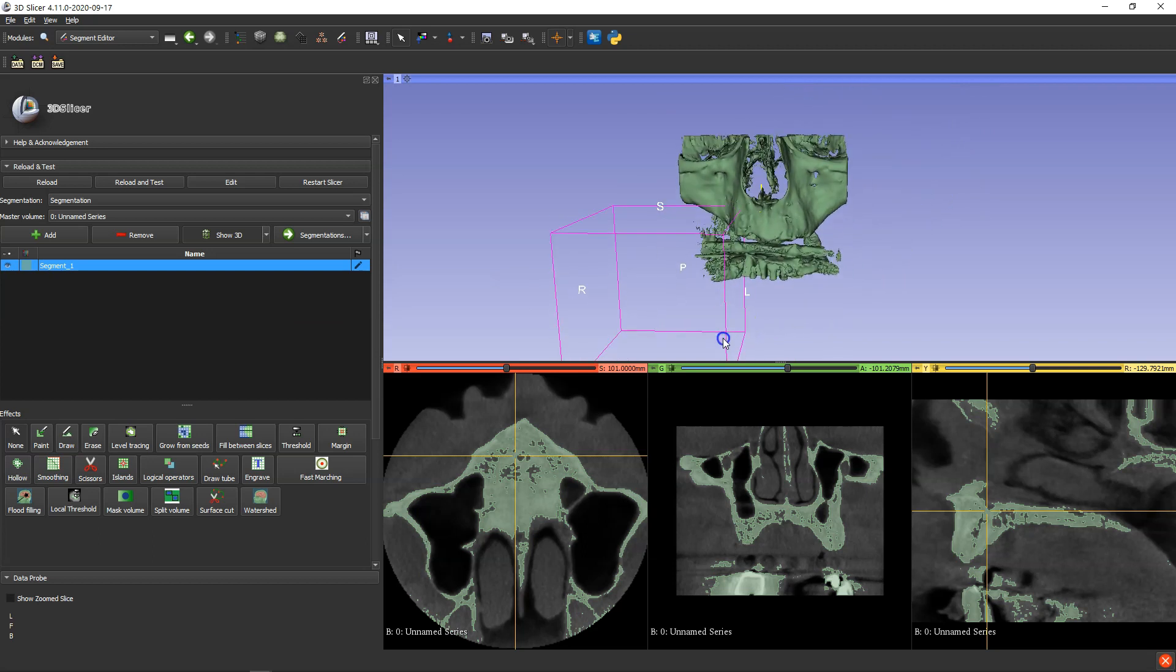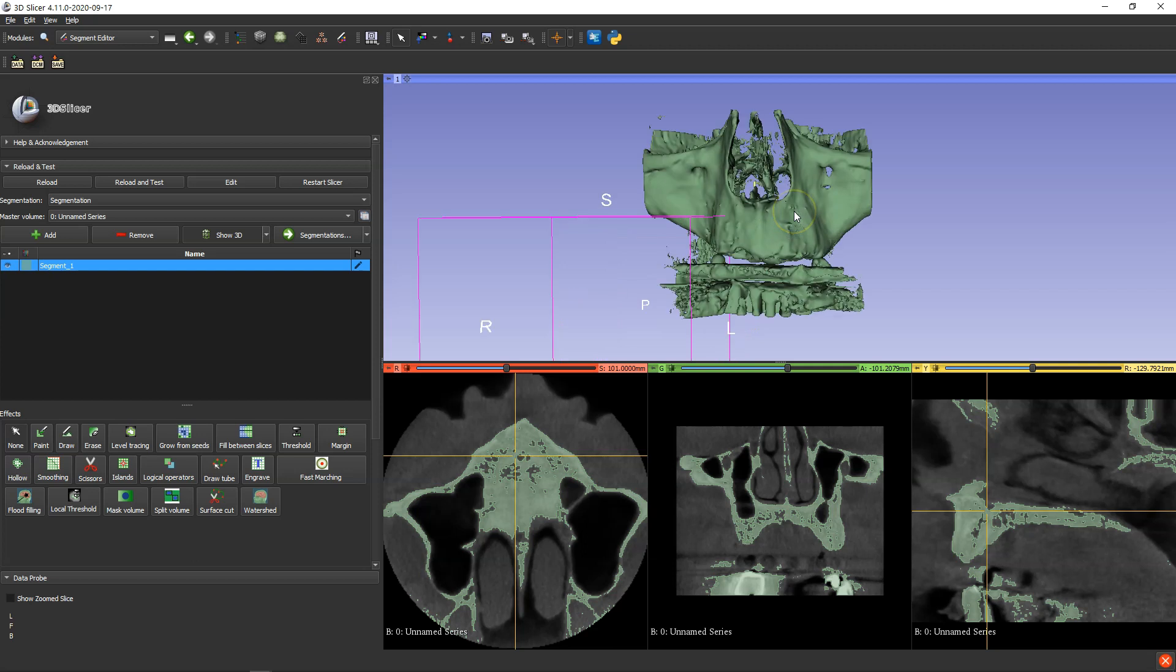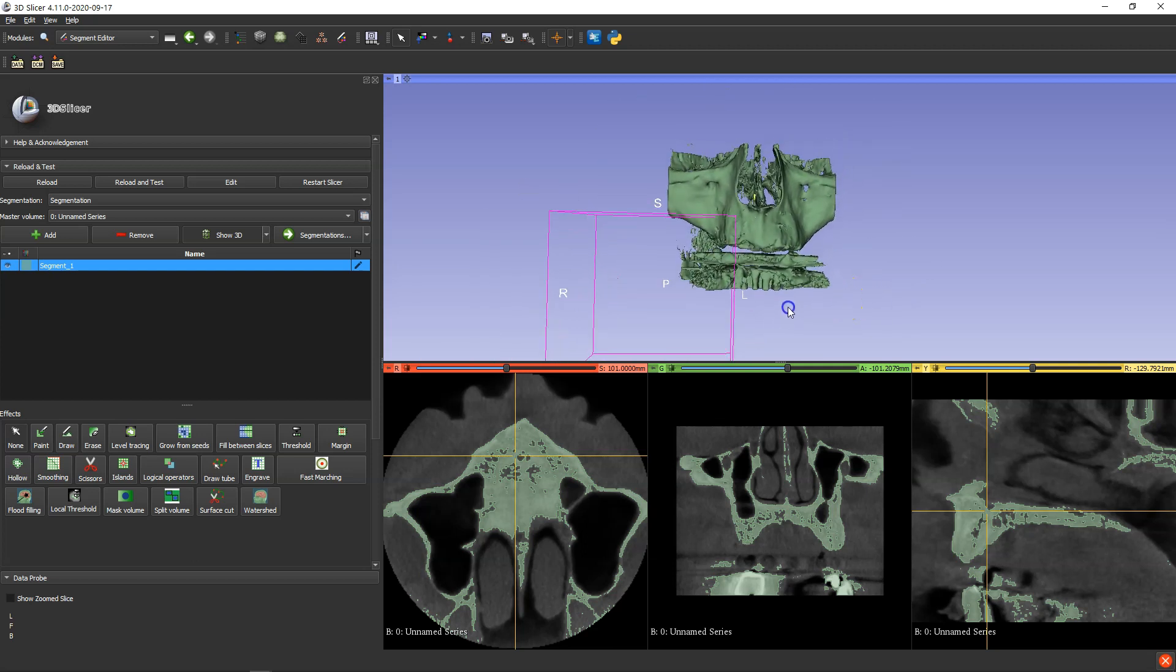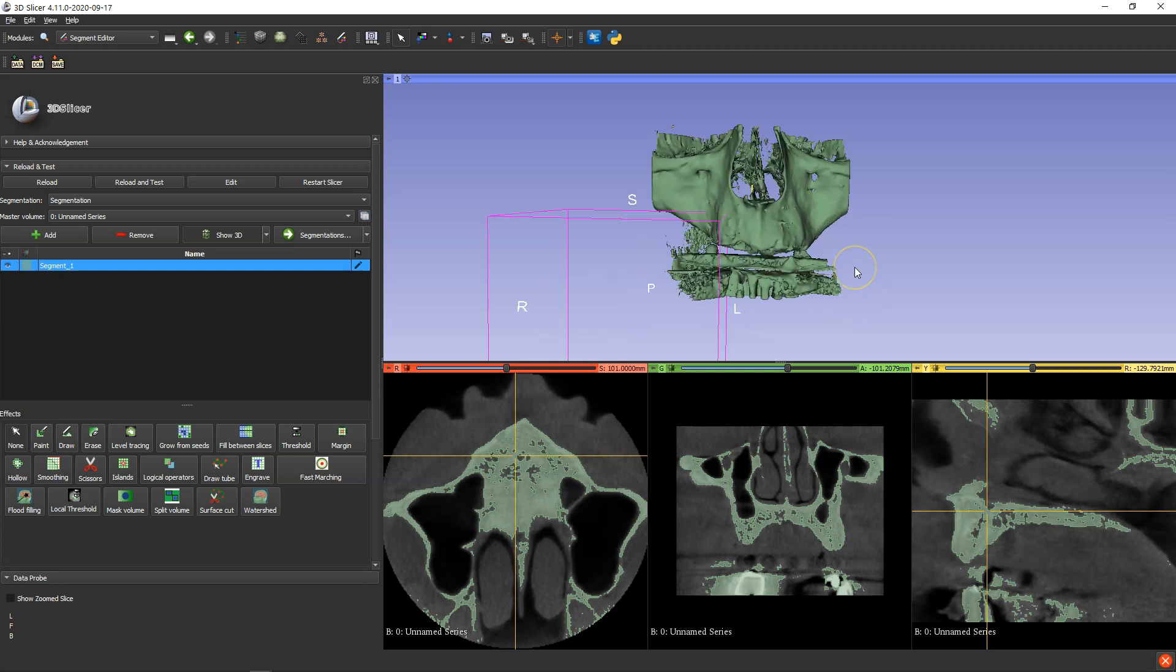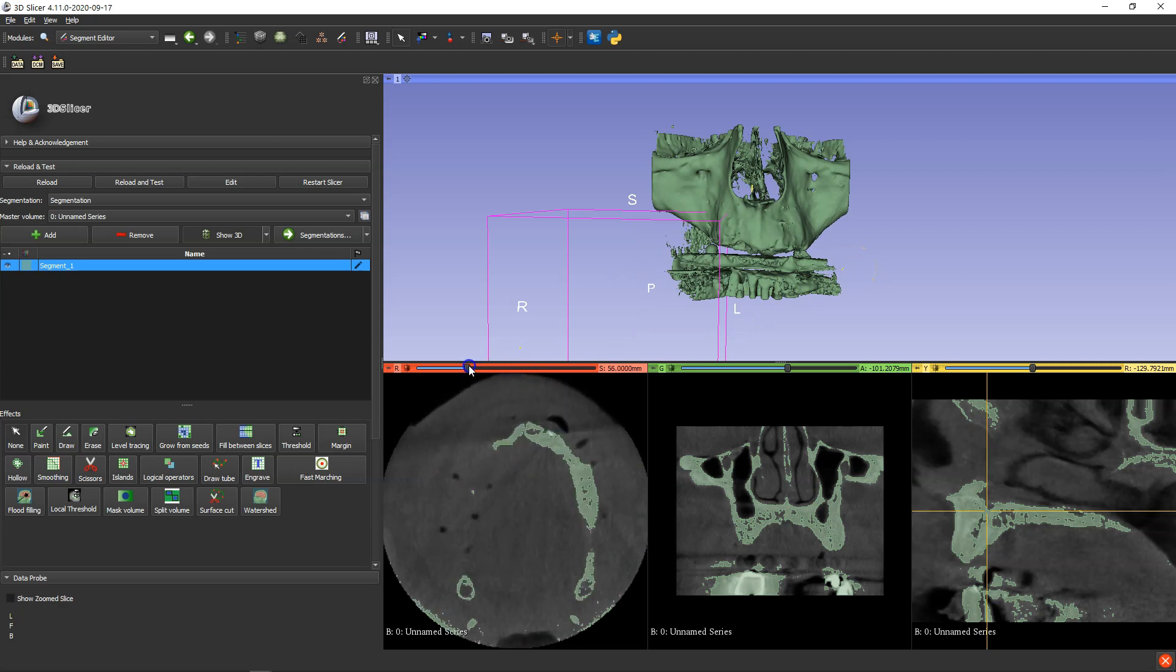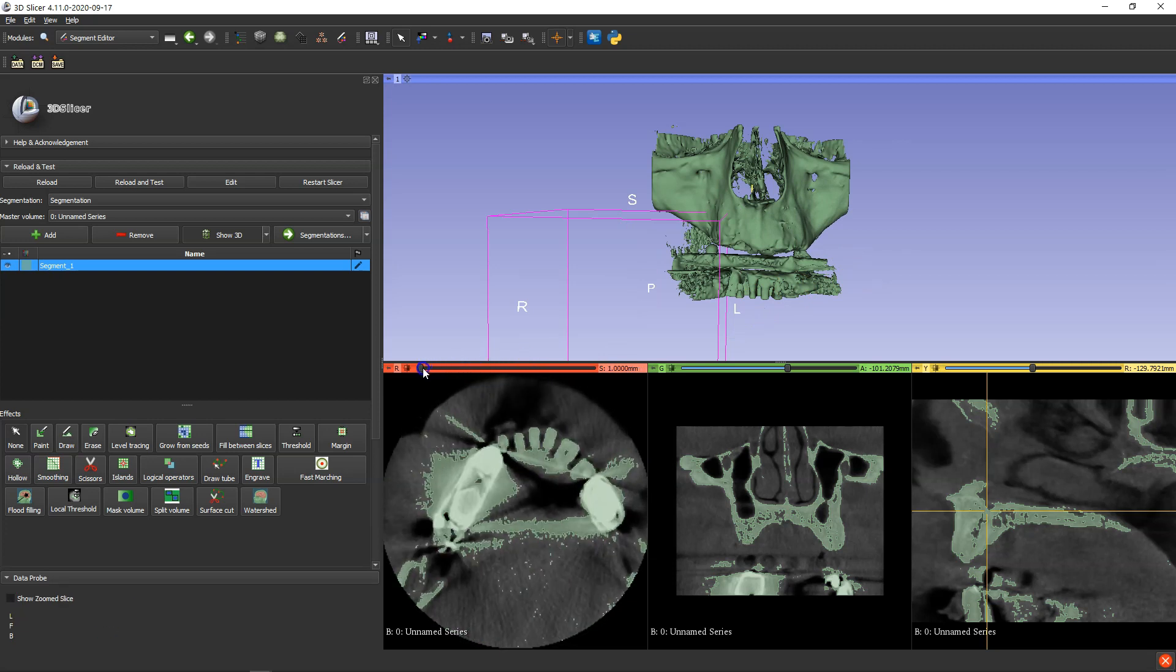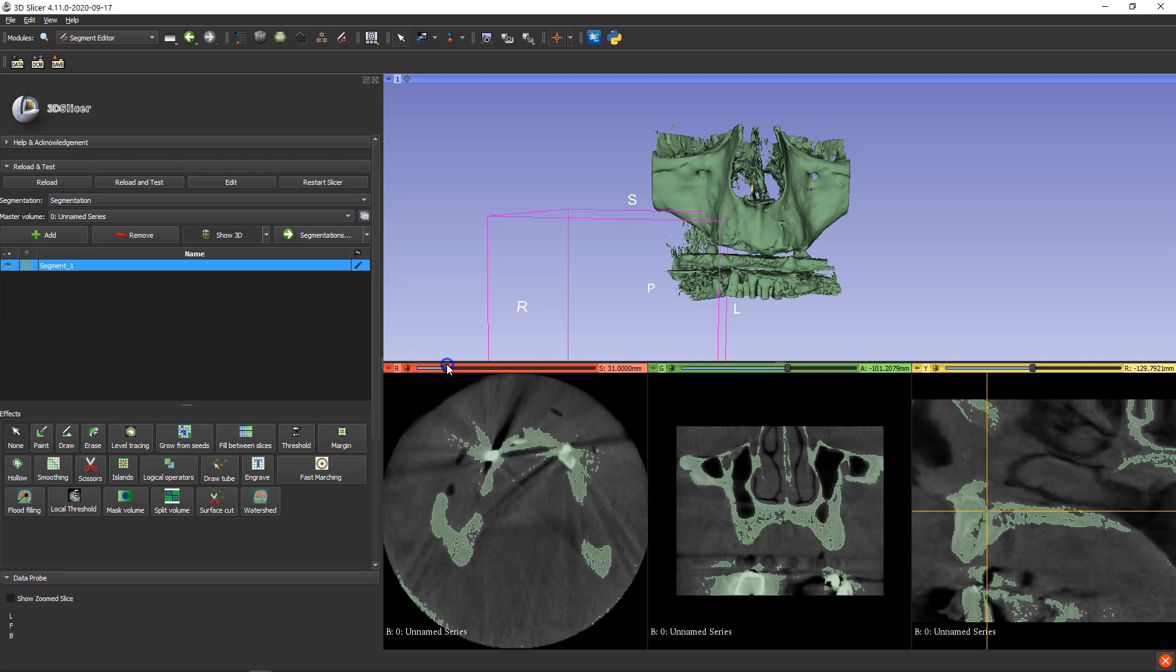Now we're going to be placing implants in the maxilla, and as you can see we've got a lot of scatter happening at the bottom. As I move through the slice we can actually pick up where the scatter is over here. And that's probably due to bridges in the patient's mouth.